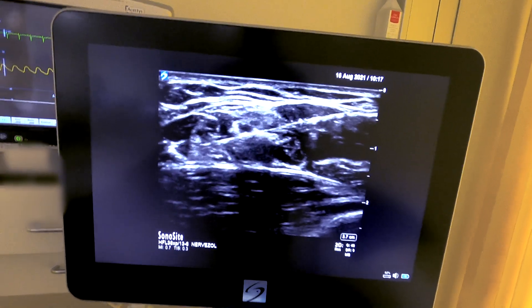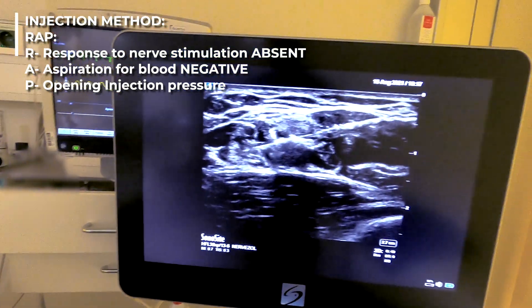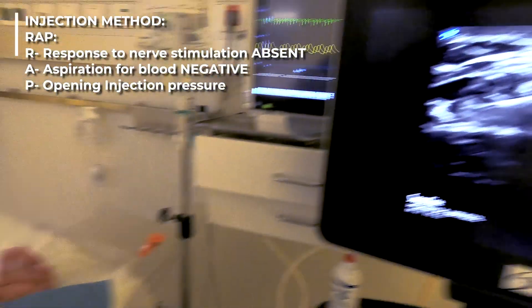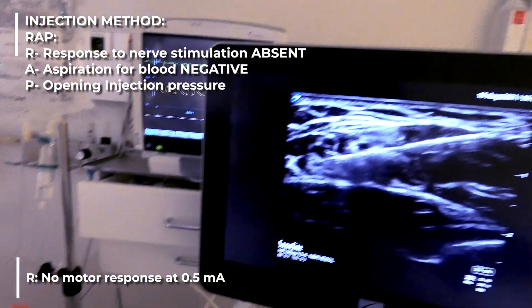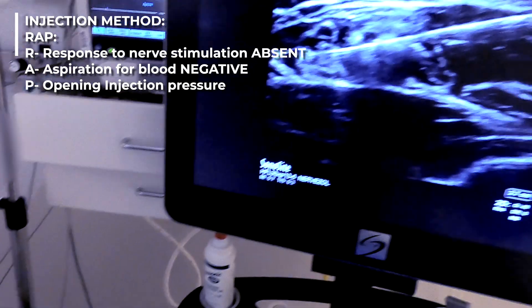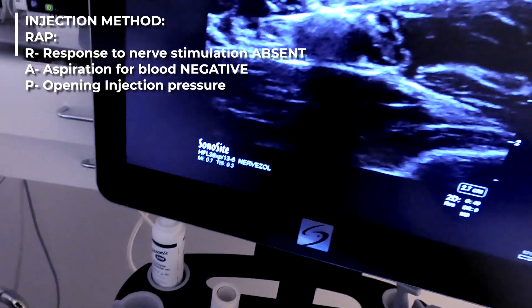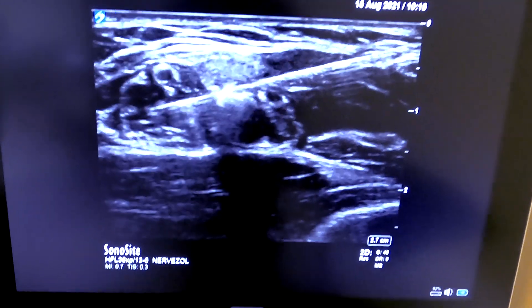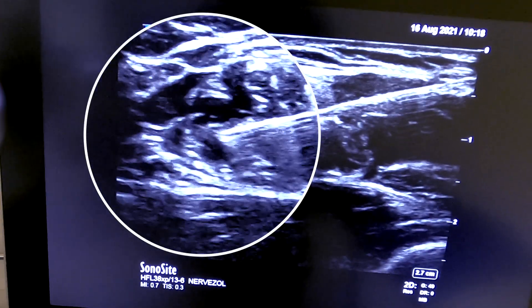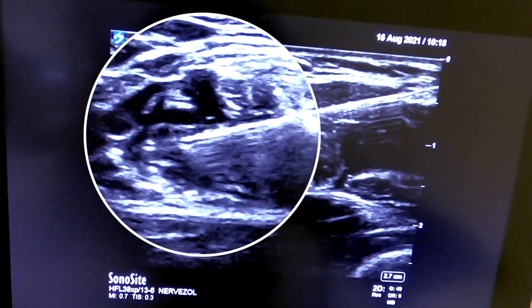We return to our injection method using the RAP protocol: R — Response to nerve stimulation is now absent; A — Aspiration to detect blood is negative; P — Pressure on injection of local anesthetic is normal. We can see the local anesthetic spreading around the radial nerve, which avoided the need for multiple injections around each individual nerve.